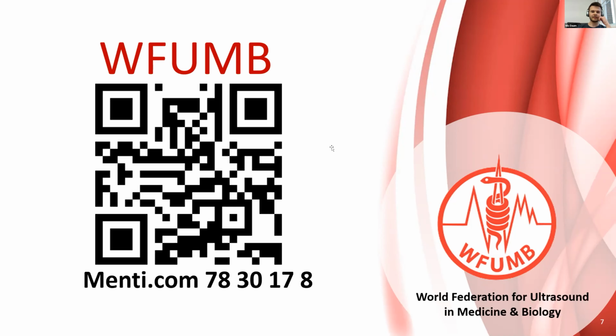Exactly. So welcome to our WFUMB Students webinar, our ultrasound quiz. And we will start with a small interaction. What you can see here is a landmark, and you can pin the country where you're from. Then we have a good overview of where you are from today. And you also have the screen here on top, where you can join while the quiz runs.